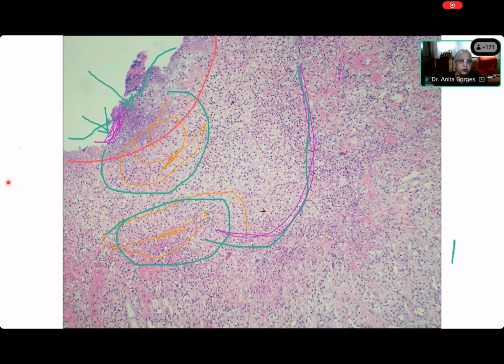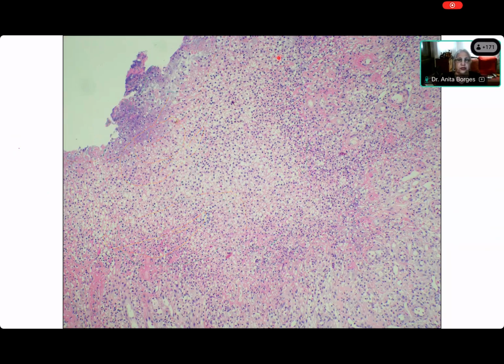Do you know what the ulcers are? What are the different parts of an ulcer? What you see from the top is the floor of the ulcer. That is the floor of the ulcer. Oh God, I did the wrong thing. I myself took the wrong thing. Yes, this is the floor of the ulcer. Whatever you are seeing from the top, with a bird's eye view, that is the floor of the ulcer.